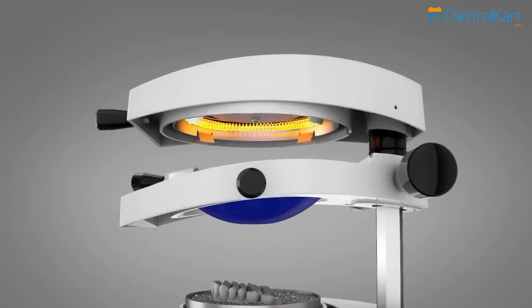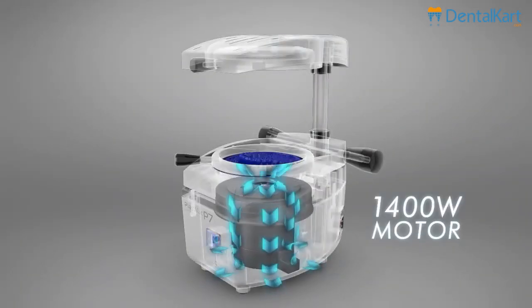To assure a perfect conformation, its 1400 watts motor with automatic start is the most powerful on the market.